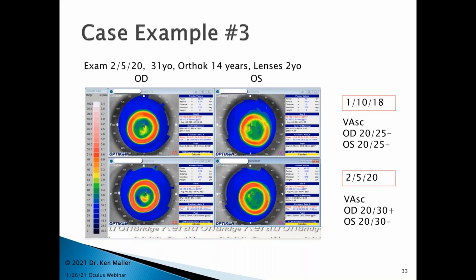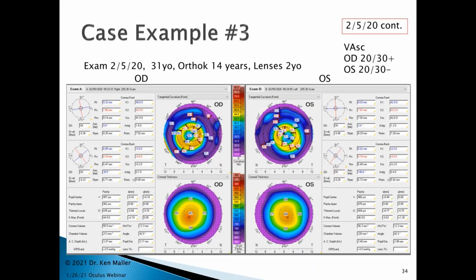But she was a little bit more vocal about the fact that she was having trouble seeing out of her right eye, and I can easily see why. So that day, we went ahead and did a Pentacam on her. And lo and behold, we can see that centrally, she's got corneas that are somewhat thin. They're 457 on the right and 466 on the left, with the thinnest point of pachymetry on the right eye showing at 435. Left eye was 454. Very, very thin corneas.